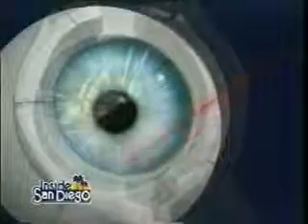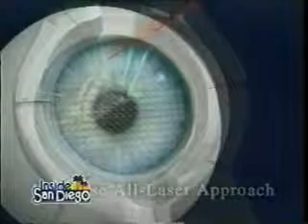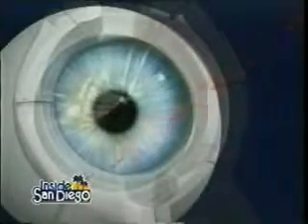Wavefront technology is where we send light through the eye and we get a wave pattern that comes back. And we measure that wave pattern. Every single person has a distinct wave print of their eye, a distinct wave visual pathway. With a distinct wave print, we can actually now treat that specific individual's eye uniquely, like a fingerprint of the eye.